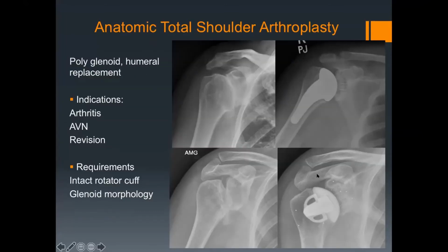Just on that, those little dots, that was part of a study. These are RSA beads that are being used to monitor the prosthesis, and particularly the glenoid, for loosening of the prosthesis. And that's why you've got all those little white dots on that. And this is the hemiarthroplasty that we use here, a stemless hemiarthroplasty.